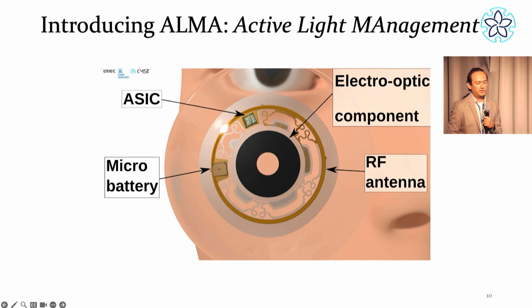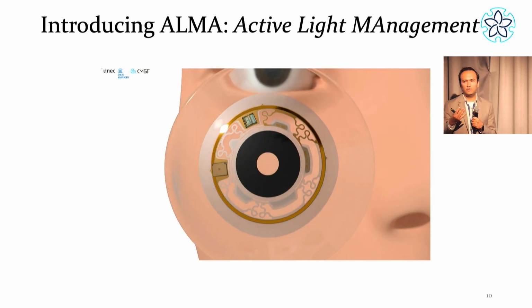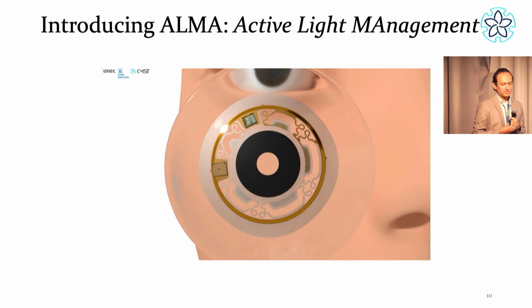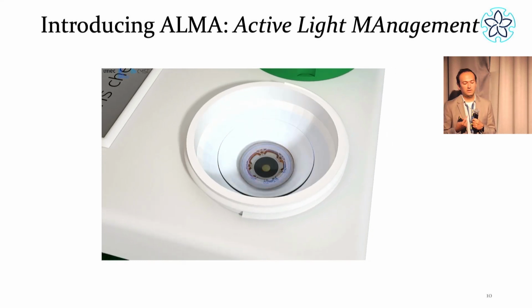This is an animation of one of the use cases. Again, here we have the main components, and the main functionality is that depending on the amount of light or by command, we can change the aperture size which is placed in front of the cornea. I will explain why this is very important for us to reduce these higher order aberrations. Then we plan also to put an artificial iris around to hide the electronics. And then, as a typical electronic device today, at night you will remove it from the eye and put it in a special charger where you can clean it with the typical liquid that you use today for contact lenses, and then you can recharge the battery, and then it's ready to run again for the next iteration.